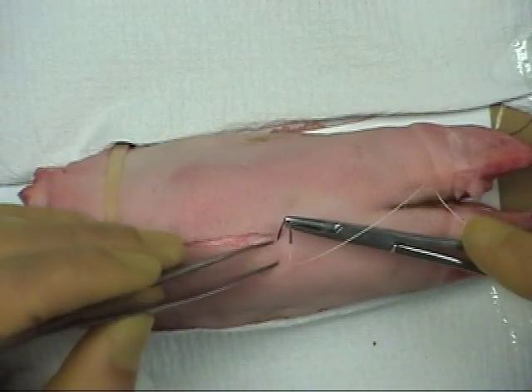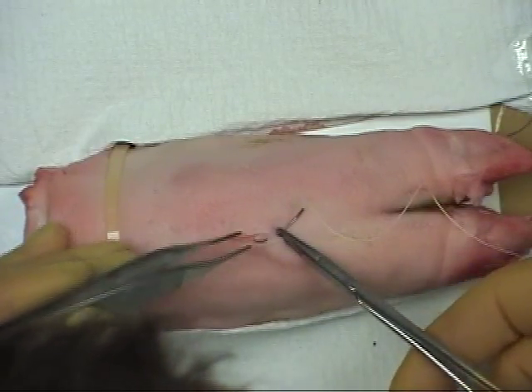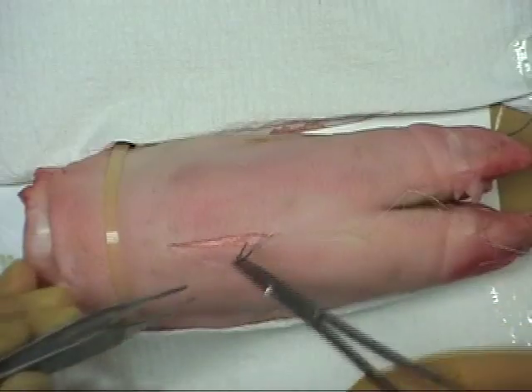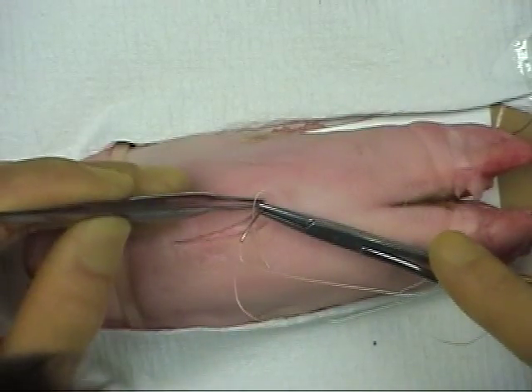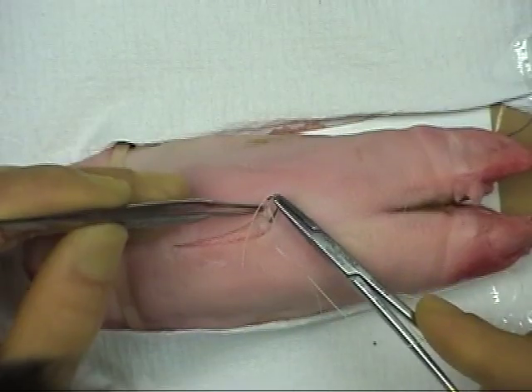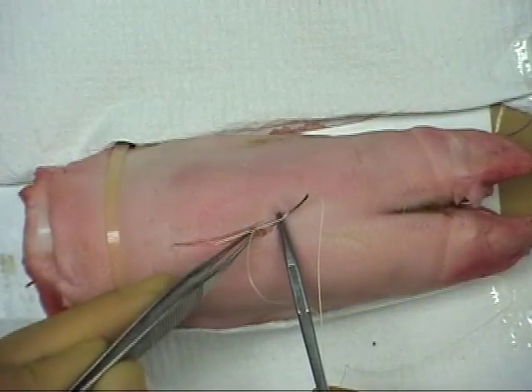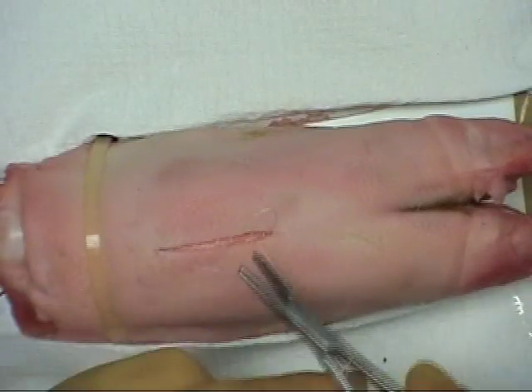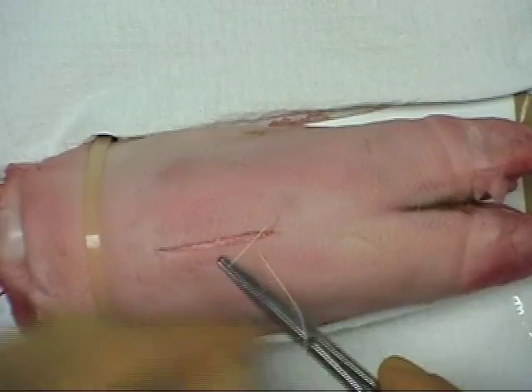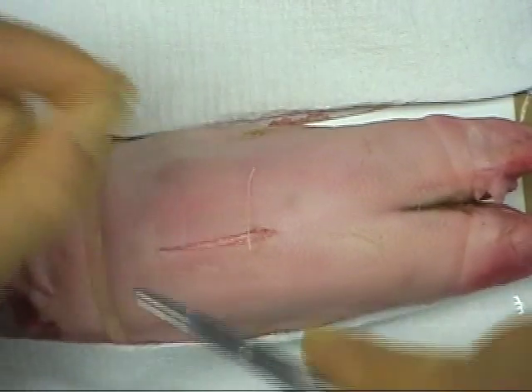The first bite is made deep and passed superficial. Starting the bite on the opposite edge superficially, it is then passed deep. A reef knot is tied with just three throws to keep the suture material in the wound to a minimum.